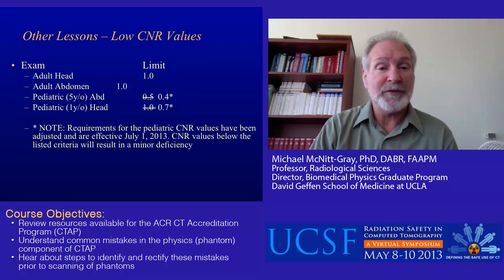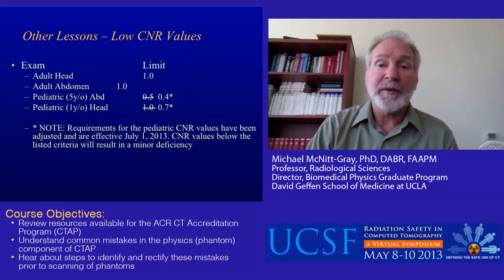Next. Some other lessons. Low contrast to noise values. These are no longer major deficiencies. These are all minor deficiencies. But let's go through the exams and the limits.